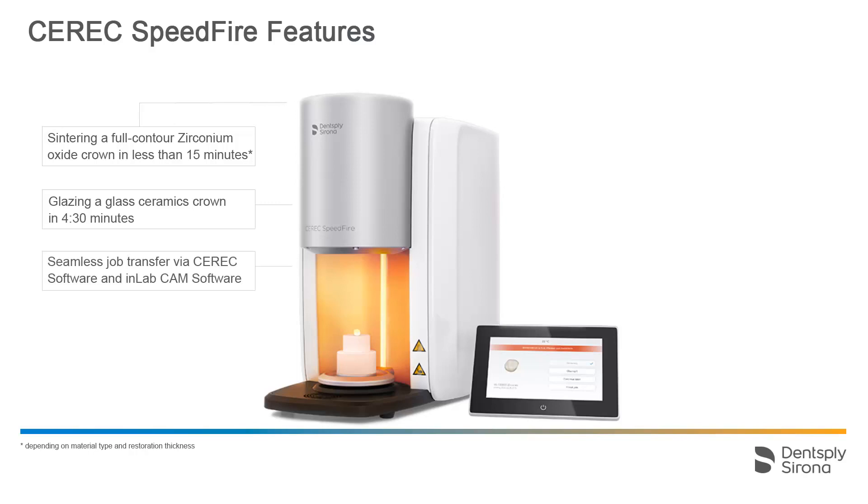The CEREC or in-lab CAM software sends each firing order to the furnace, including all necessary information. Validated programs for Dentsply Sirona materials, as well as partner materials, provide excellent aesthetics and material-related strength of the restorations.